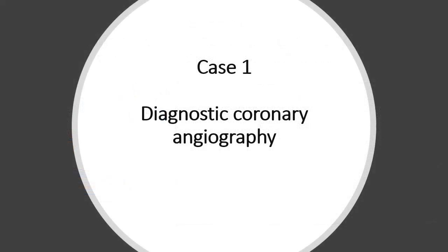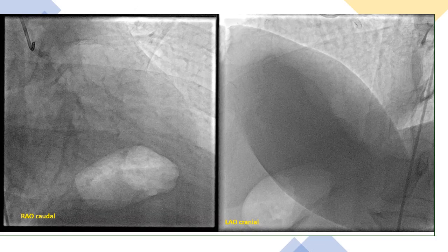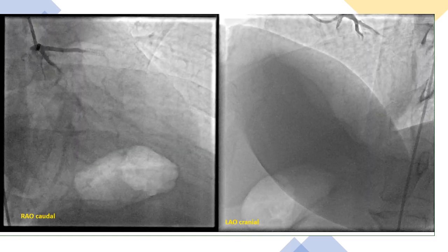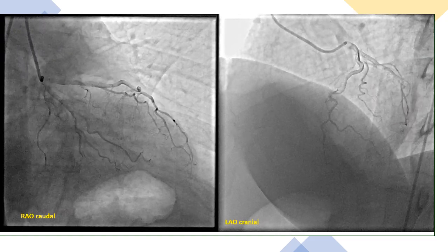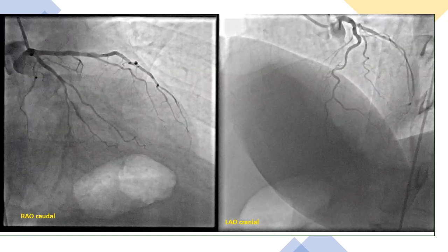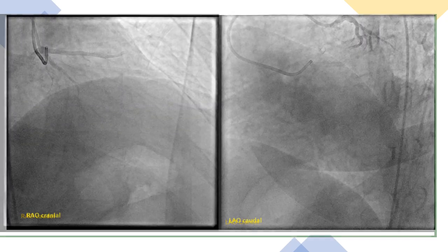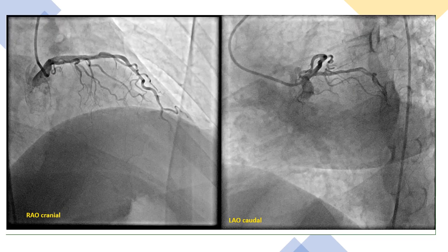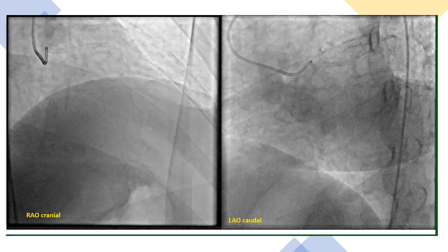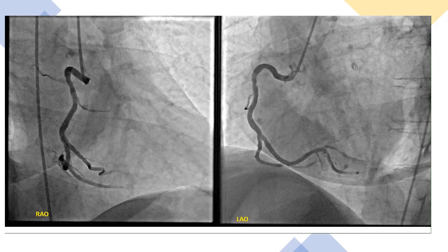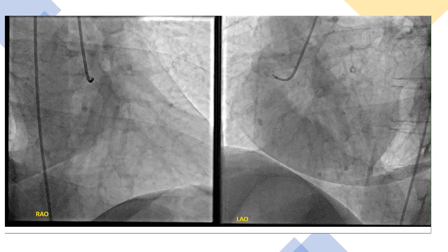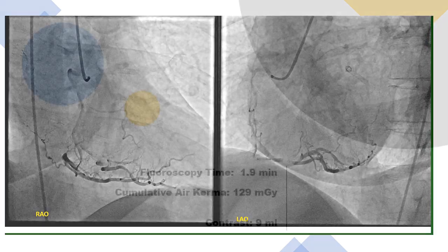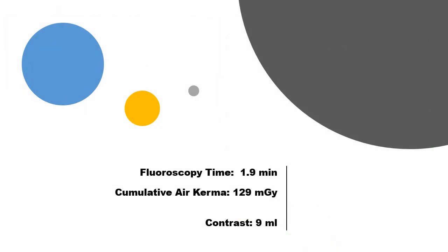Moving on to some examples, we will start with a case of diagnostic coronary angiography. After adjusting the isocenter, we took our images — these are our initial simultaneous RAO caudal and LAO cranial views. We then adjust the image intensifiers and take the other two orthogonal shots: RAO cranial and LAO caudal views. We engage the right coronary artery and take two orthogonal views — straight RAO and LAO. Fluoroscopy time in this case was only 1.9 minutes, and we only used 9 cc's of contrast for the whole case.